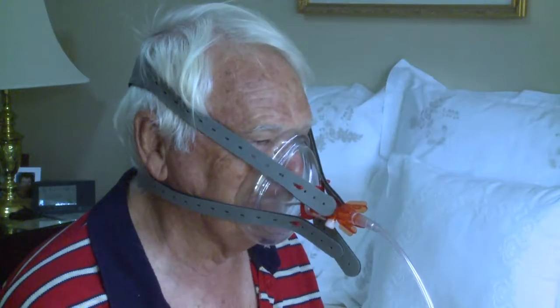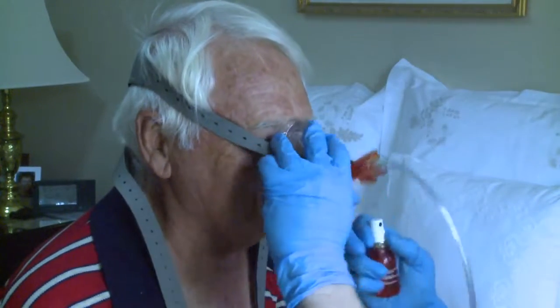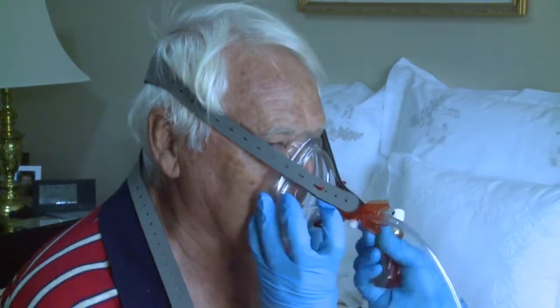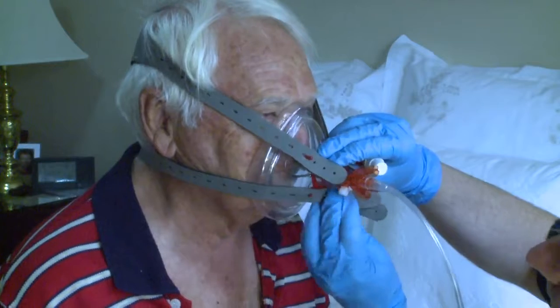If at any time the patient requires the administration of sublingual medication, simply release the bottom harness straps and lift the mask. This will provide access to the patient's mouth. Once the medication has been administered, simply reattach the harness and ensure an airtight seal.